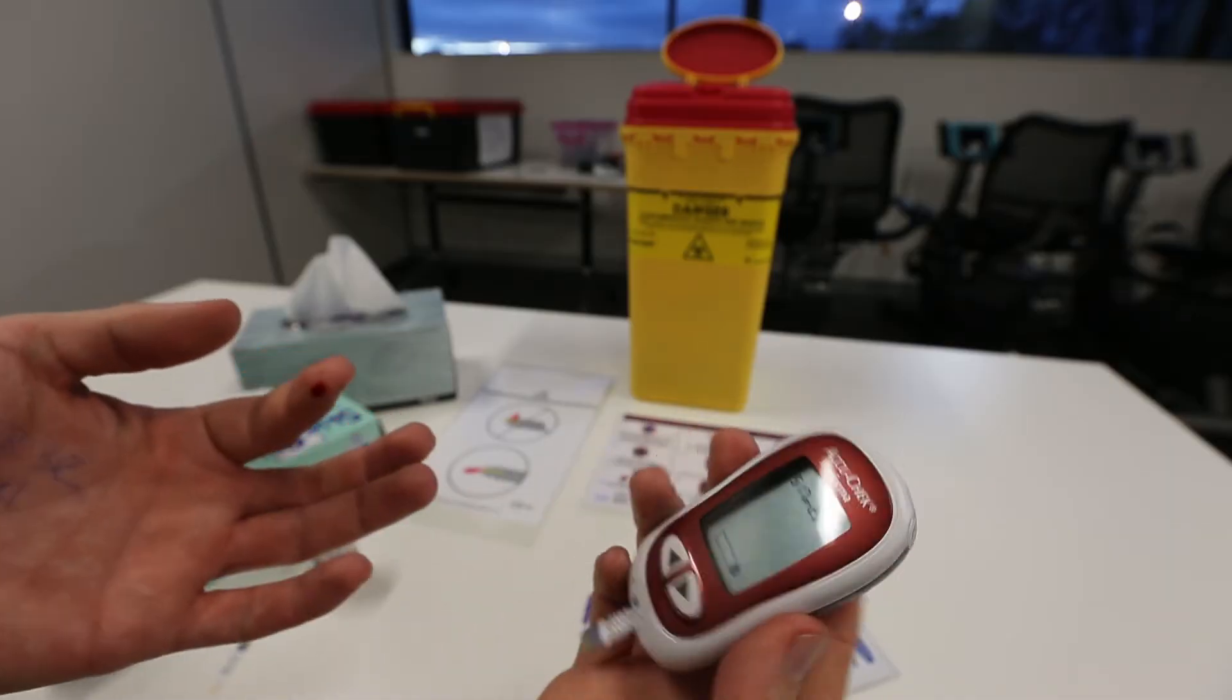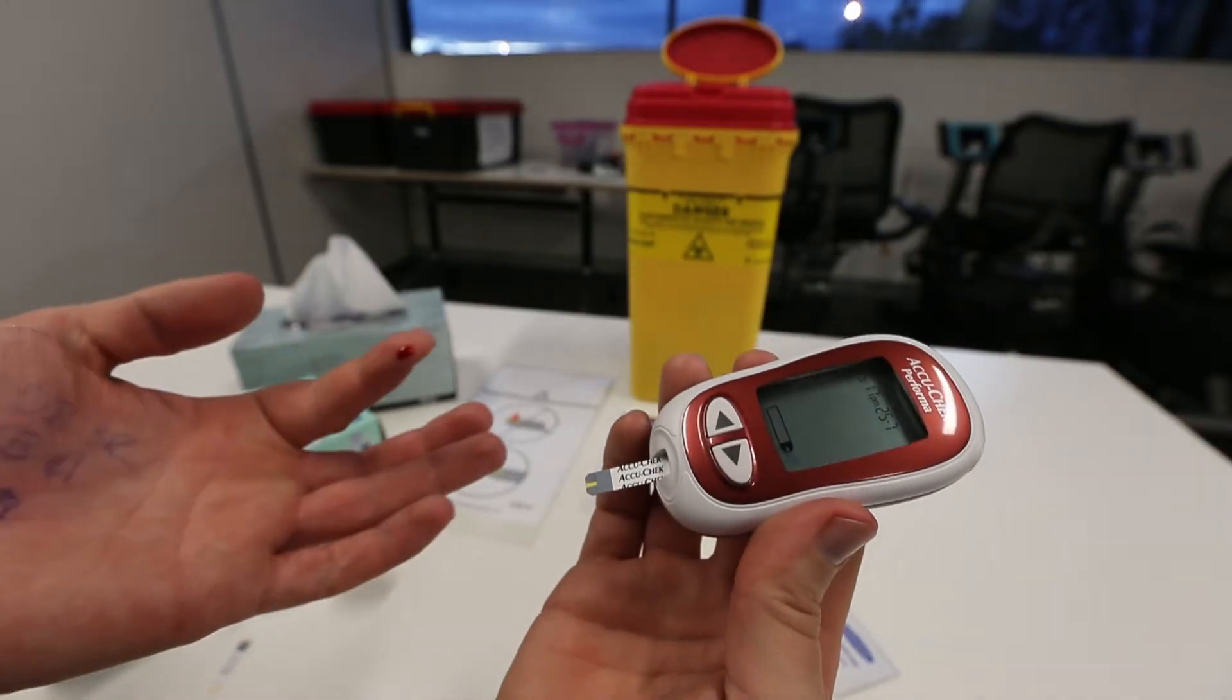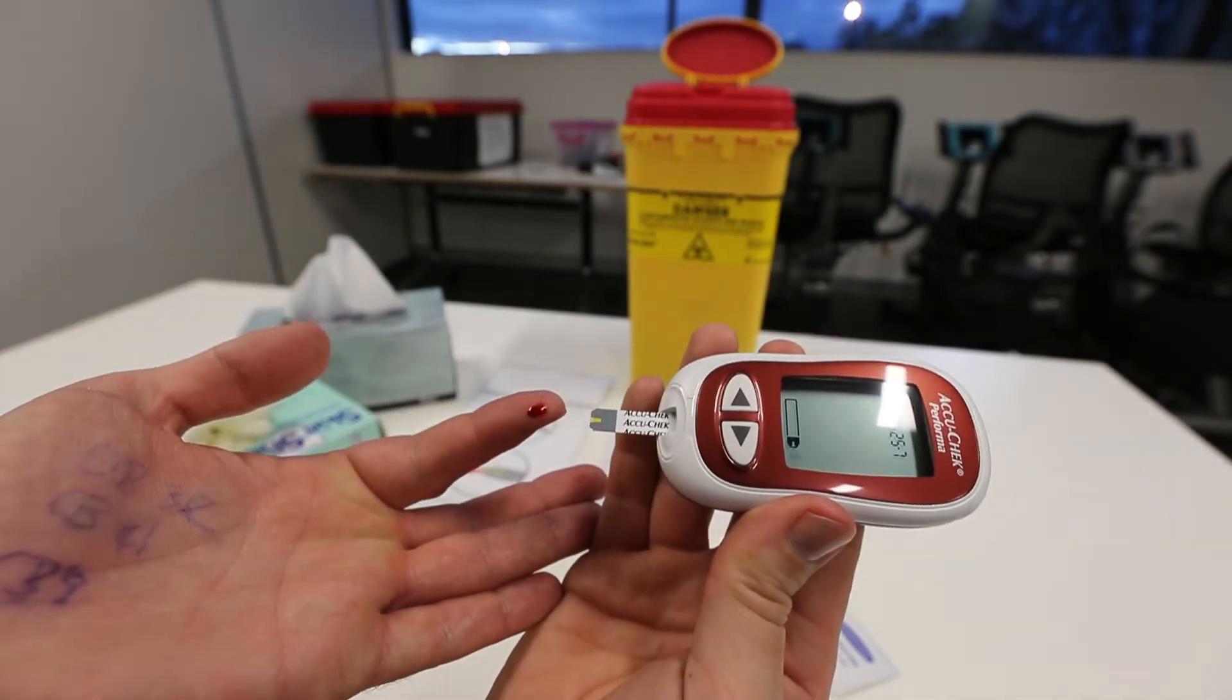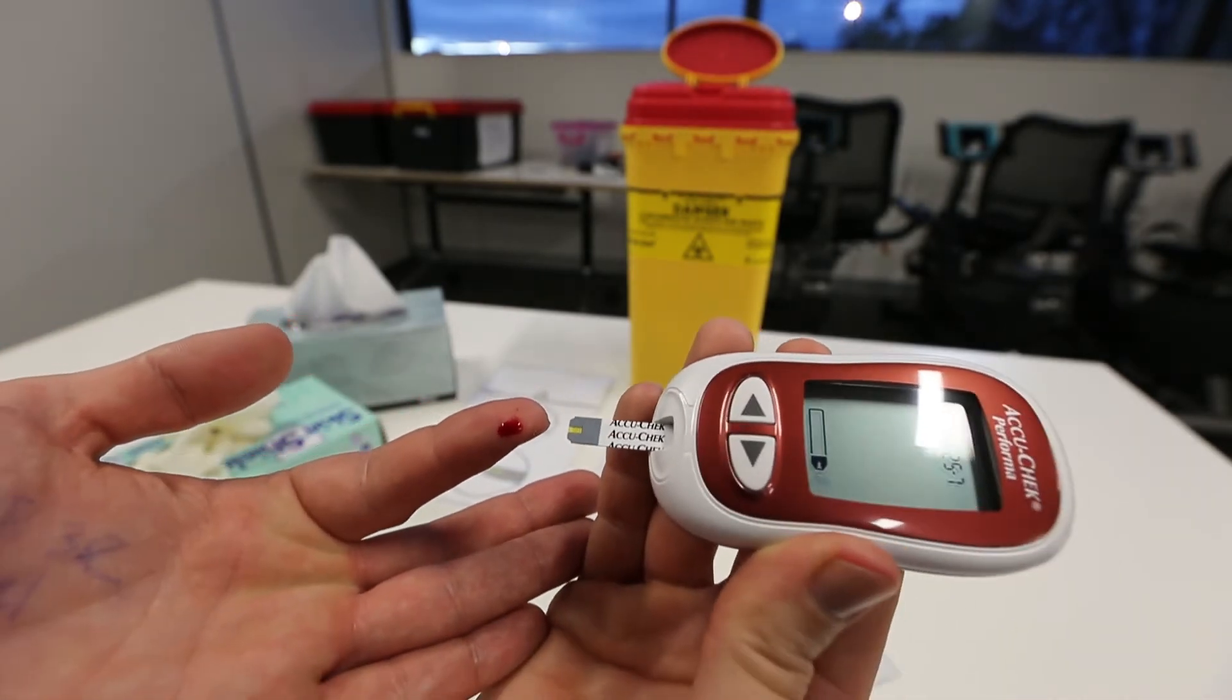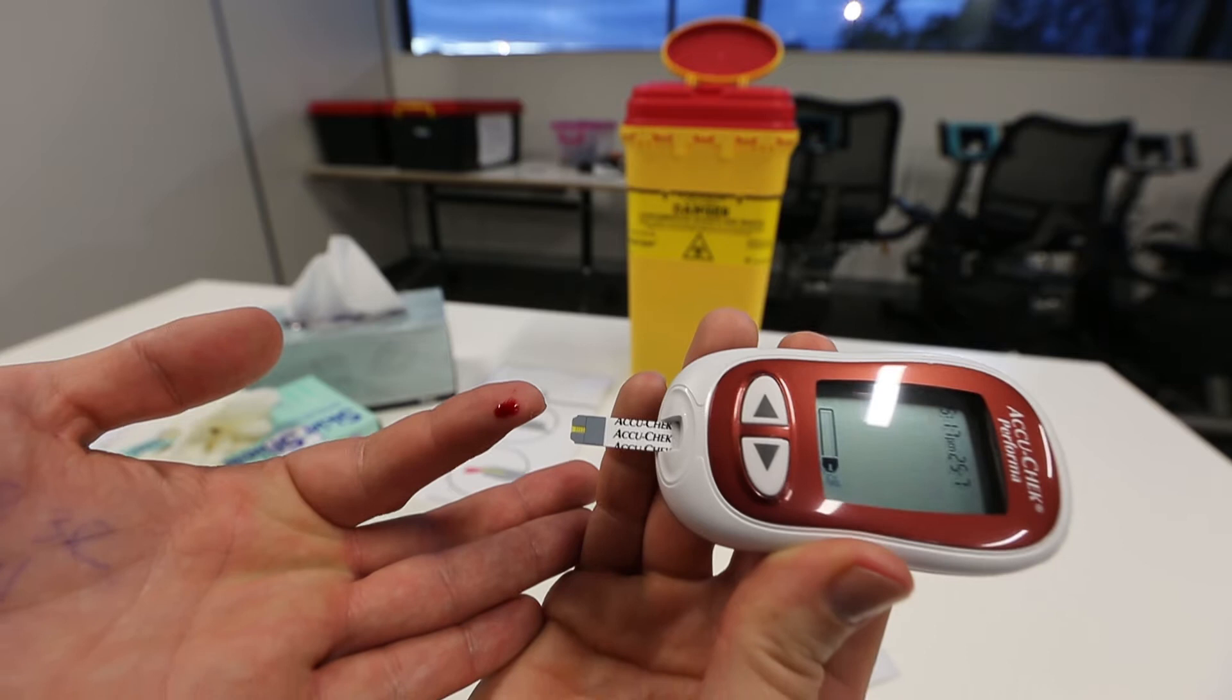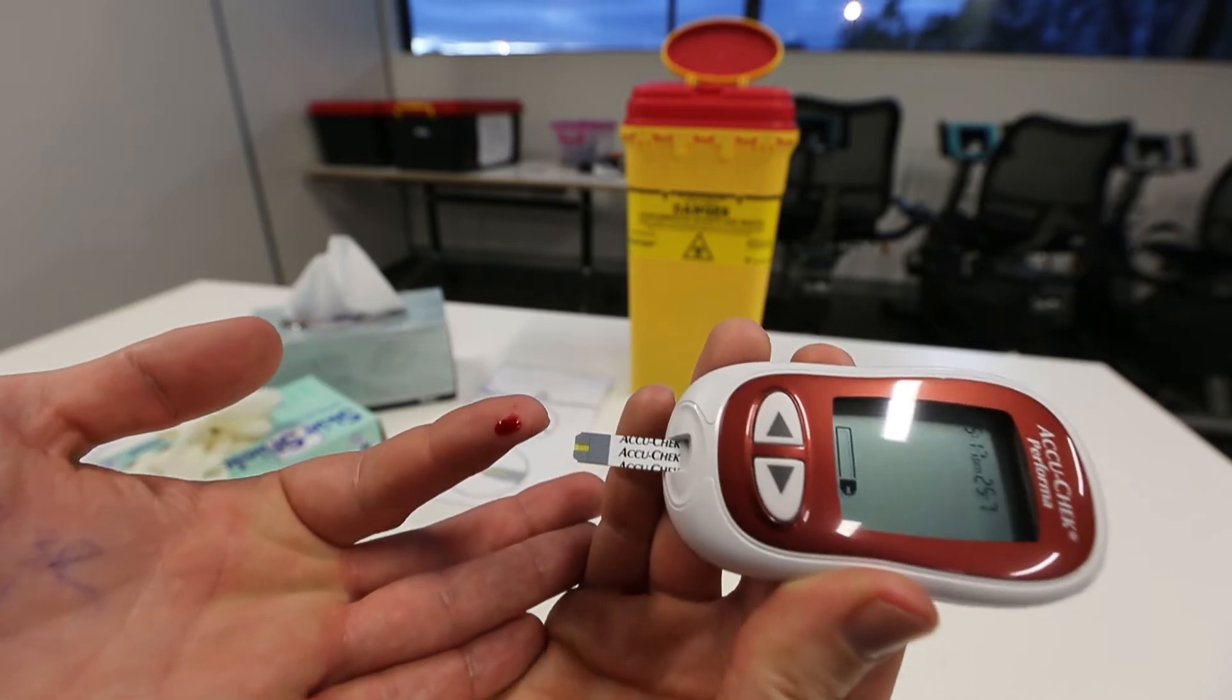Once again, approach the blood droplet perpendicularly with the end of the test strip. This will allow the blood to be drawn by capillary action up into the yellow test area.